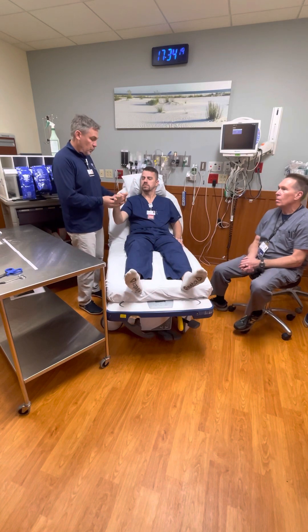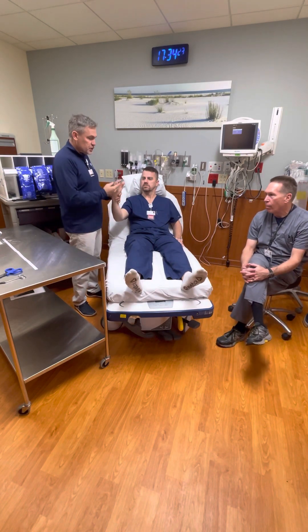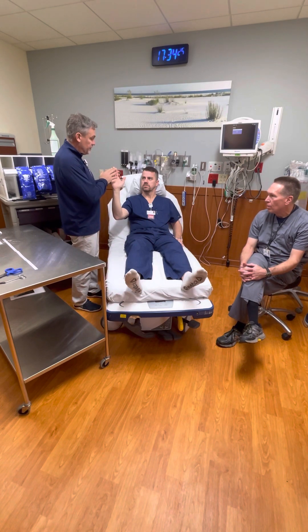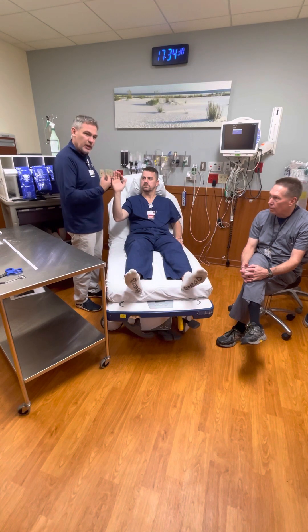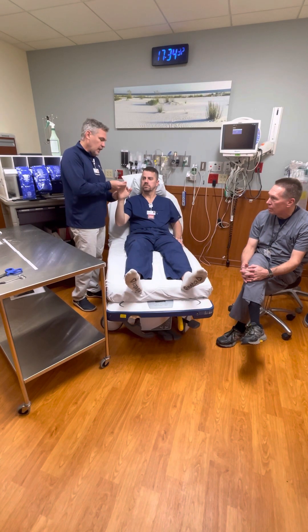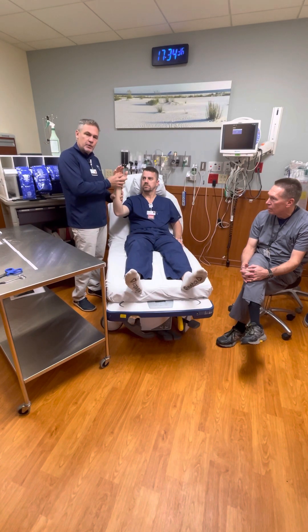At the end of this when we're done, the patient's still going to be able to move their fingers. We're still going to be able to assess their blood supply by looking at capillary fill in each one of their fingers, making sure they're getting good supply and it's not causing a lot of pain, compression, or basically strangulation to the arm.